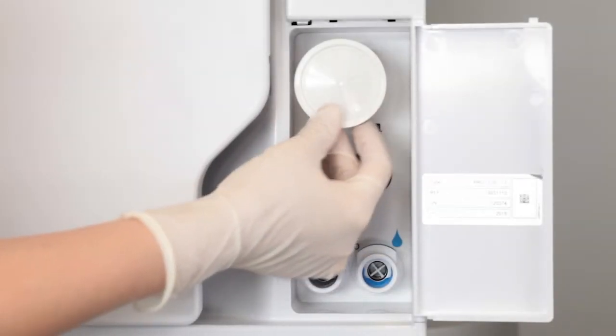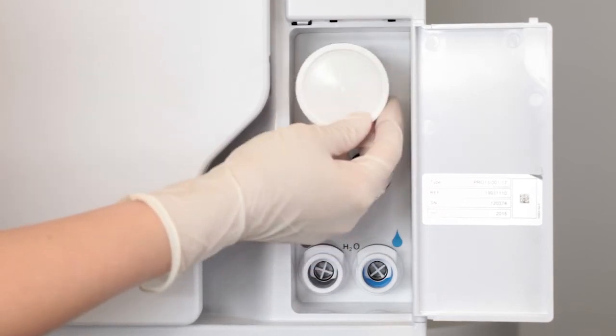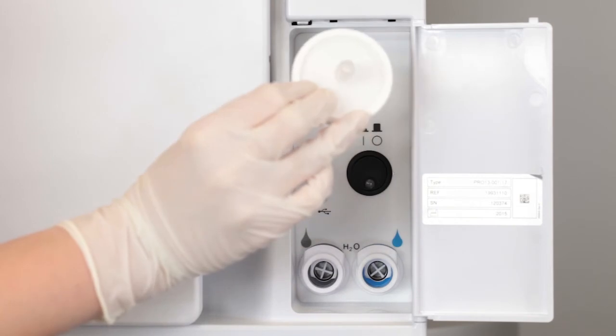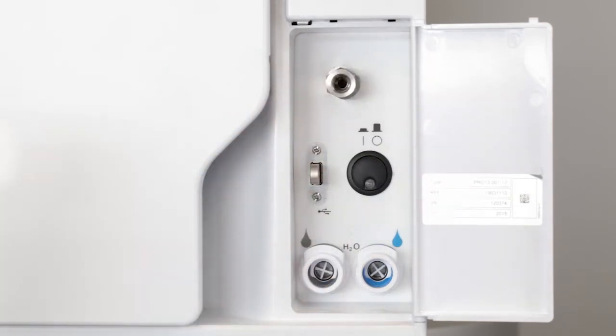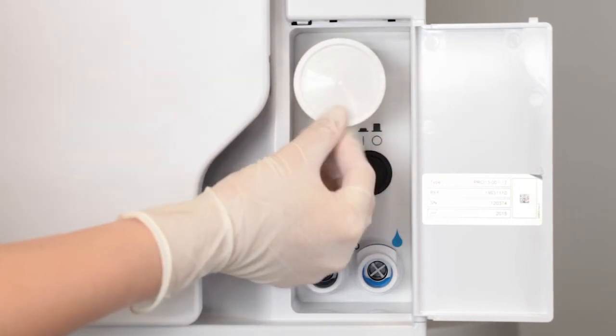When replacing the filter, unscrew it anti-clockwise and remove it. Remove the new filter from its packaging and screw it clockwise into the thread until tight and firmly attached.